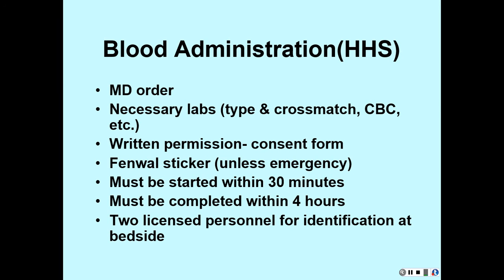So even before you go to get the blood, you need to have your consent signed. You need to have your patient's vital signs and assessment done. You need to have your IV going. So when you go to the lab, get the blood, you come back, you do all the identification things, you hang your blood and start it to infuse.